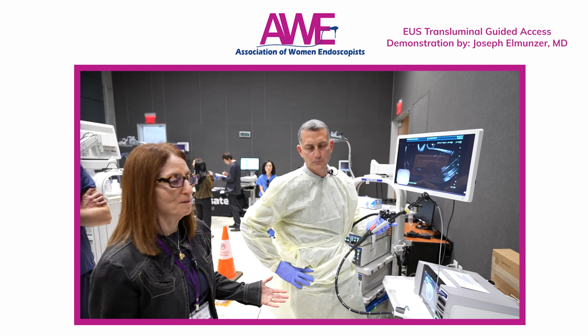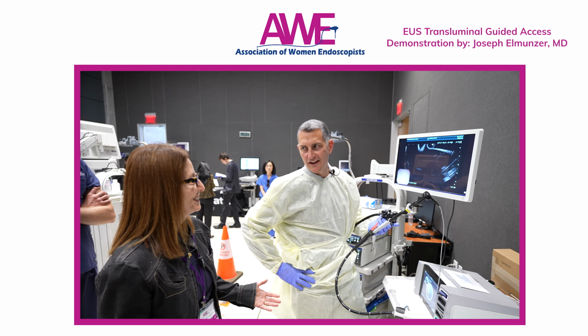Typically, I call it the grand slam of EUS-directed therapy, when you do all of that in one session.